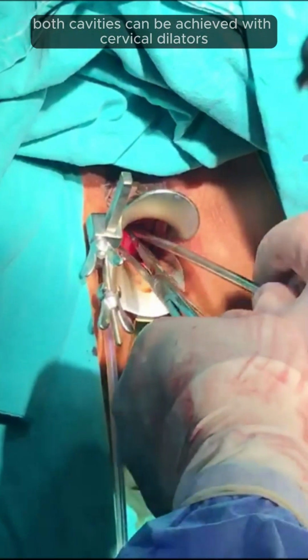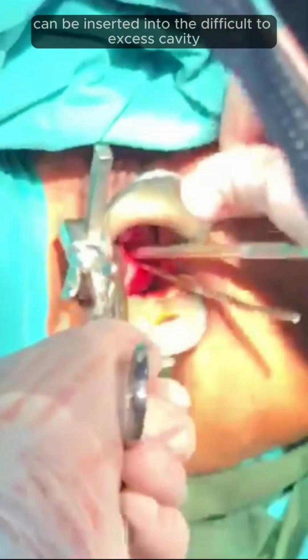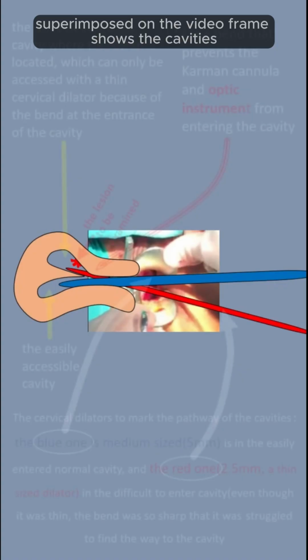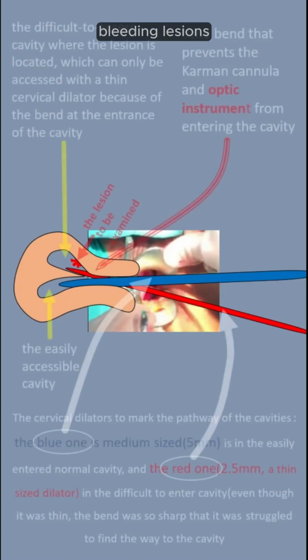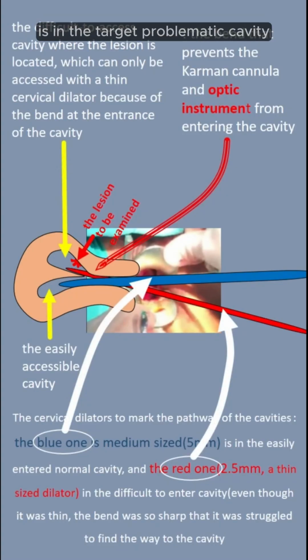Cavities can be accessed with cervical dilators, but a thick dilator can be inserted into the easily accessible cavity, while only a thin one can be inserted into the difficult to access cavity. This schematic drawing superimposed on the video frame shows the cavities, bleeding lesions, difficult slope at cavity entrance and dilators. The thin red one is in the target problematic cavity.